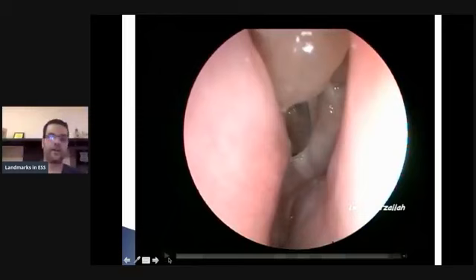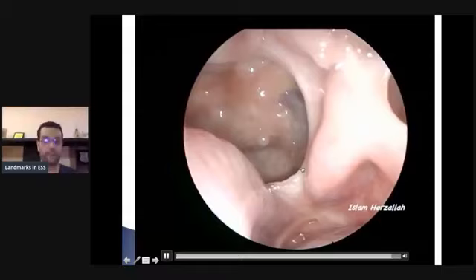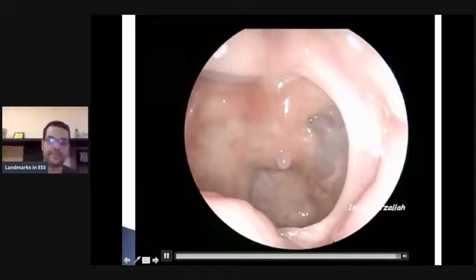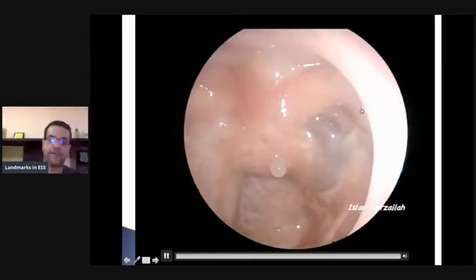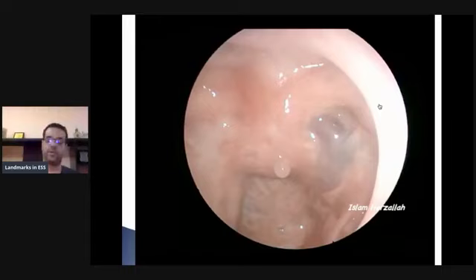By the way, this is a partial middle turbinectomy, a partial one to allow the postoperative irrigations to reach this region very well. And see, this is the extended sphenoidotomy right there. And you see that's the dehiscent ICA pulsating. And you see the sella, you see the optic nerve right there, the OCR, this region is pretty much clear. And by the way, the patient has regained most of her vision. She still had a little bit of blind spots in the visual field, but the patient was extremely happy, sees almost like normal.